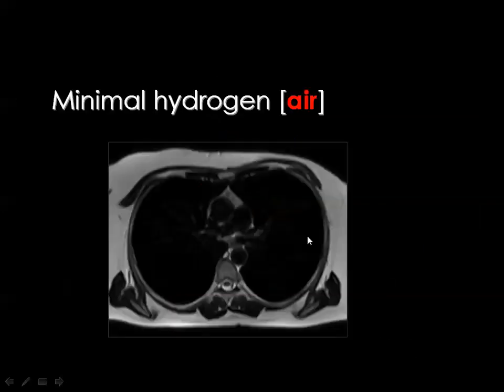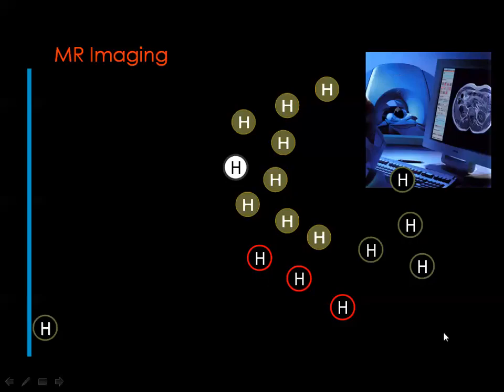The lung on MRI cannot be imaged by the regular ways, and there are several limitations for MRI imaging of the lung in particular, but it has good advantages in imaging of the mediastinum, the chest wall, and other parts except the lung, which contains air. Then what about these hydrogen protons, which are running very fast compared to the imaging?